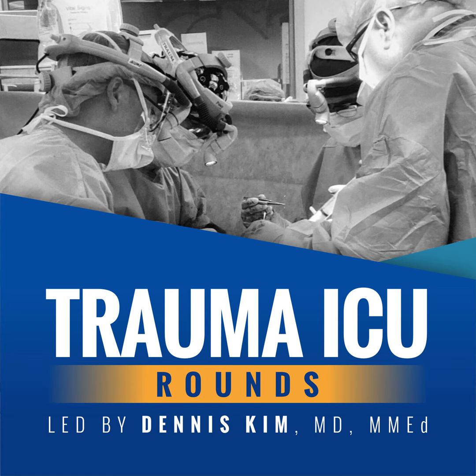The fourth and other reason or indication for intubating and placing a patient on the ventilator, at least in the world of trauma, are patients with severe TBI where they have a refractory intracranial pressure or intracranial hypertension. In these situations, we can actually use the ventilator as a therapy to decrease ICP. By hyperventilating patients, we can reflexively cause vasoconstriction in the cerebral arteriolar circulation, thereby decreasing flow into the cranium, with the understanding that we may also risk worsening tissue hypoxia with this strategy.